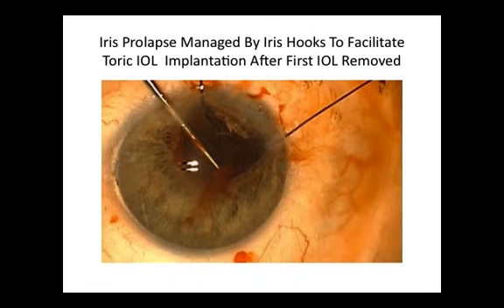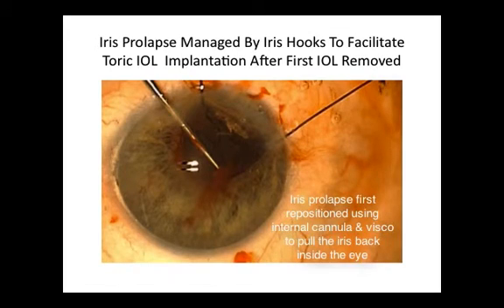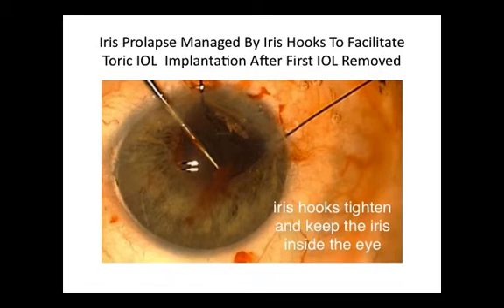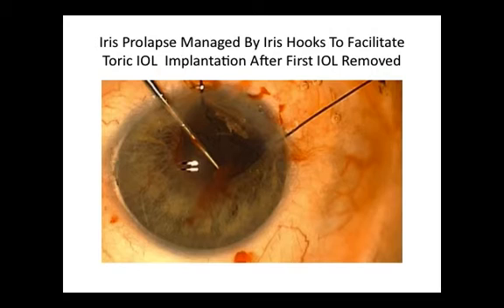In this case, the key point was to manage the iris prolapse by firstly gently reinserting the iris with viscoelastic material into the eye, and then subsequently tightening the iris and pulling it posteriorly under the corneal section by way of two posteriorly placed iris hooks. The pupil enlargement was then sufficient to facilitate toric intraocular lens entry and its appropriate positioning at the correct meridian.